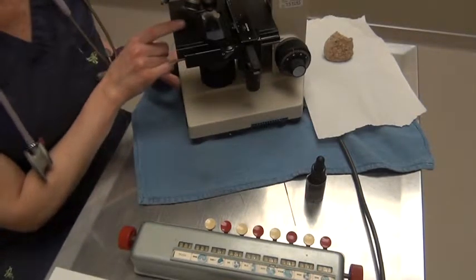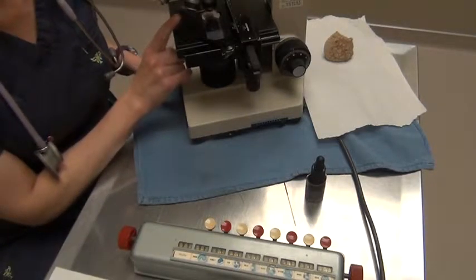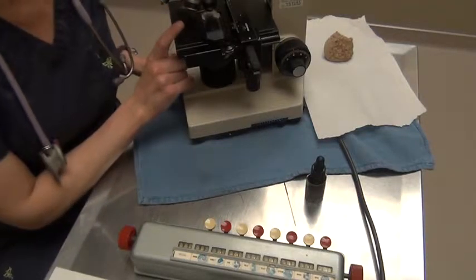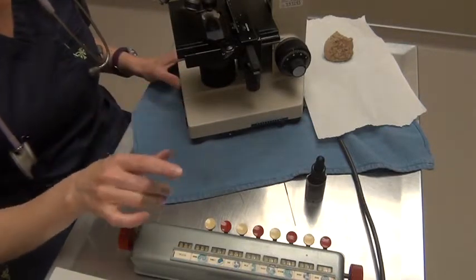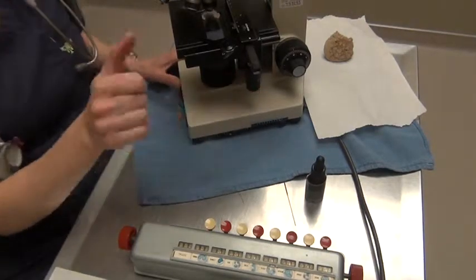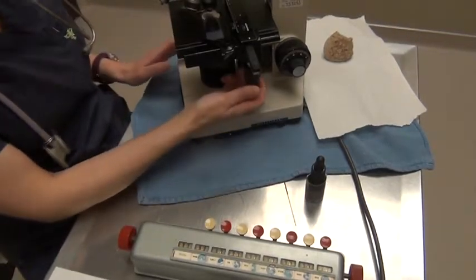I have the second area, which is my count area. It's called the monolayer. The cells are a little bit more spaced out and easier to see. There's just a lot more space between the cells. And then we have the feathered edge. When you get to the feathered edge, you will see a lot of clumping. You'll see what actually look like streaks on the outside, and that tells you basically where to stop. So we want to go in between the body or dense area and the feathered edge, which is the monolayer or the counting area, excuse me.